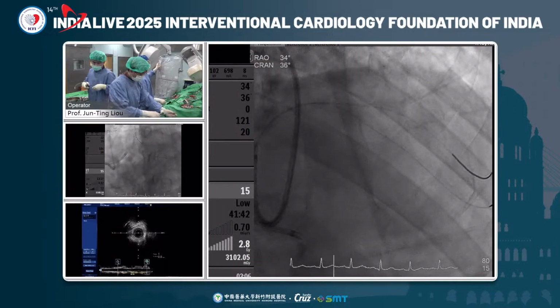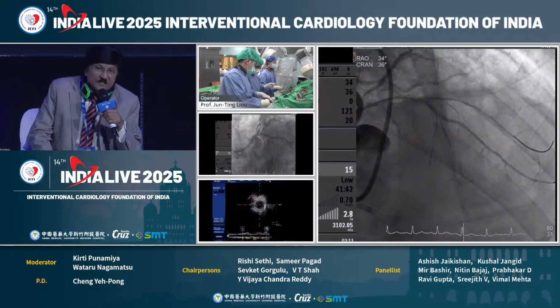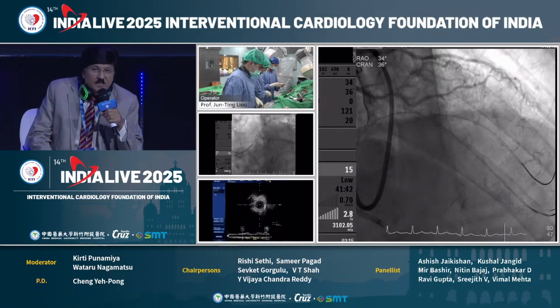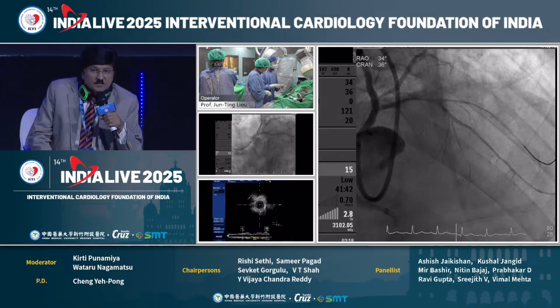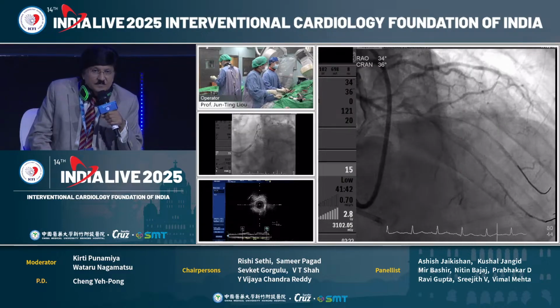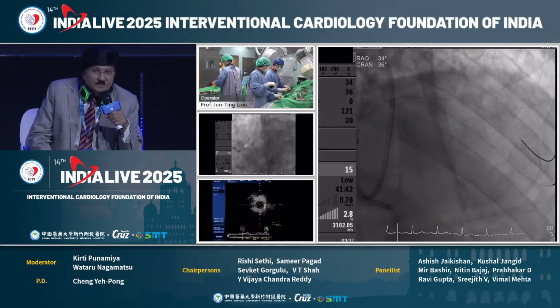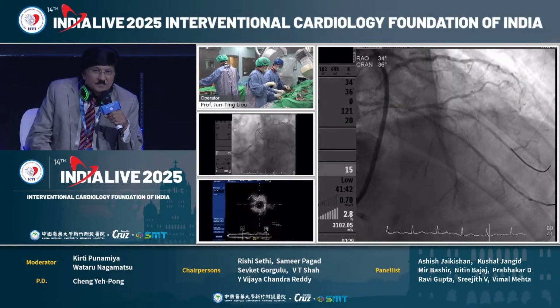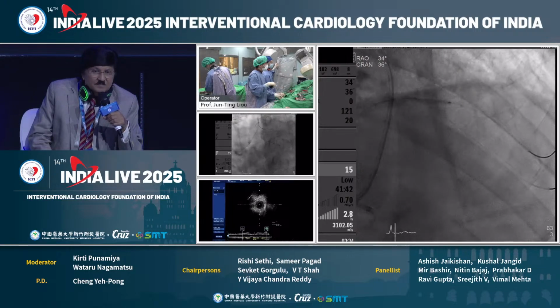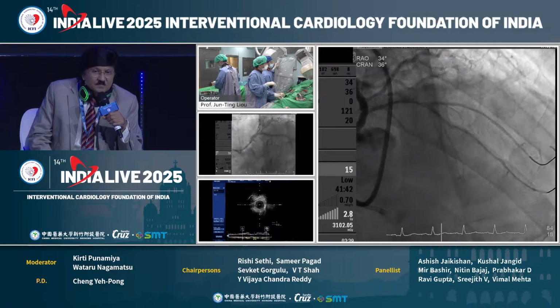Let's see, Professor Leo, where are we now? Yes, thank you. We have 5 minutes with you now. We have made a little progress here, and we put two wires, one to LAD and one to diagonal. We can see the diagonal flow is very poor. Once we stent from proximal LAD to mid LAD, maybe the diagonal will be jailed. So we use balloon dilatation here to open up the important long diagonal, DB2.